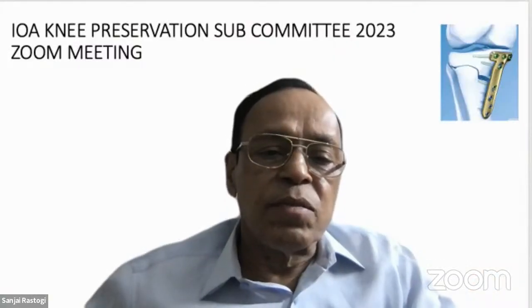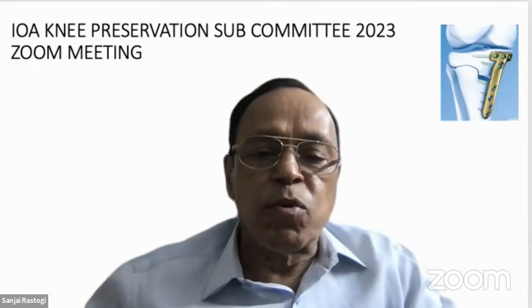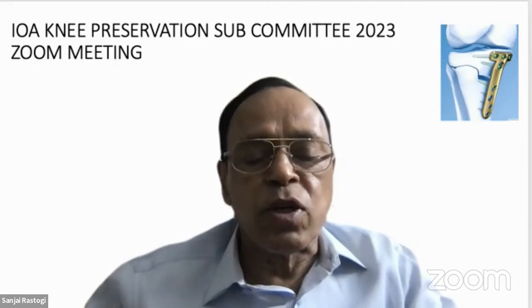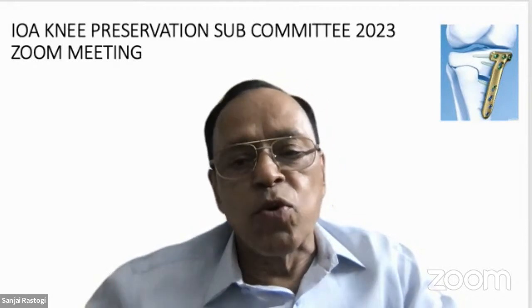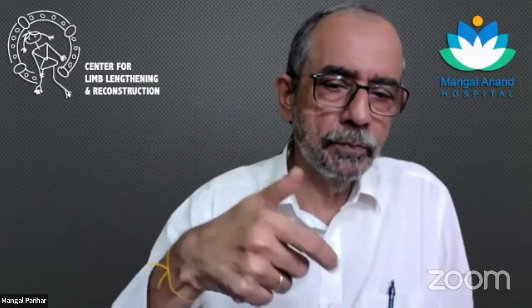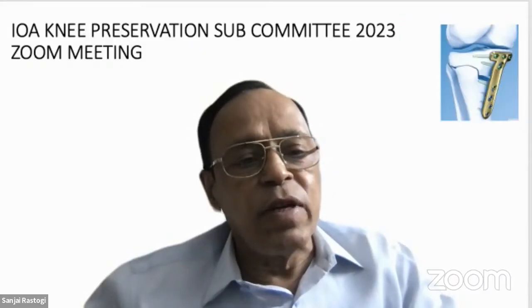The other method of not perforating the opposite cortex, which I've learned, is that you only drill the proximal cortex. The rest of it, you just push a little bit through the cancellous bone. There is that woodpecker sort of method. Yes, drill and push, drill and push, till you reach the opposite cortex. That works pretty well.